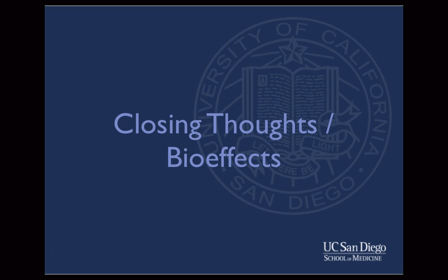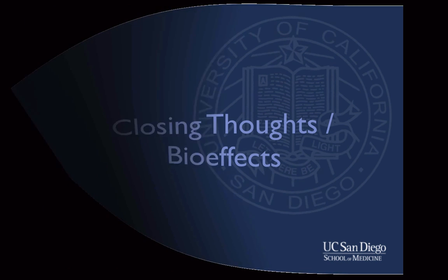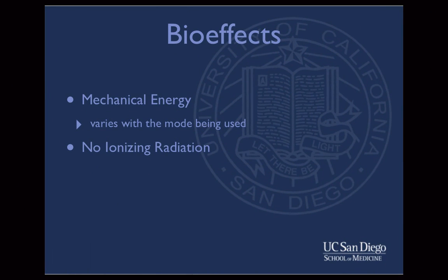We will conclude this introduction lecture with a discussion of ultrasound bioeffects. As mentioned previously, ultrasound, like all sound waves, is a form of mechanical energy. The output of energy will vary with the mode being used. For example, the Doppler modes result in more energy output compared to B mode and M mode. There is no ionizing radiation involved in diagnostic ultrasound.